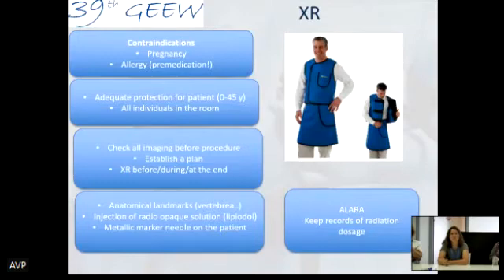So you say, okay, doc, what are we going to do? And you have the plan and you prepare your material according to that. And the X-ray is there ready to guide you throughout the procedure. You can use many anatomical landmarks like the vertebra for measurements and also to be sure of what you're looking for.